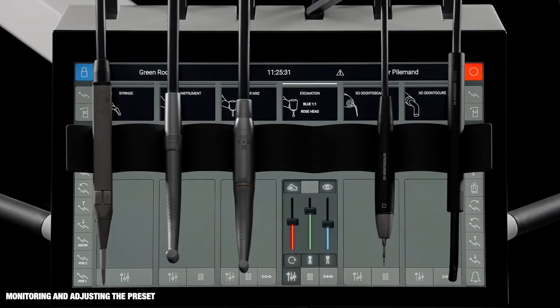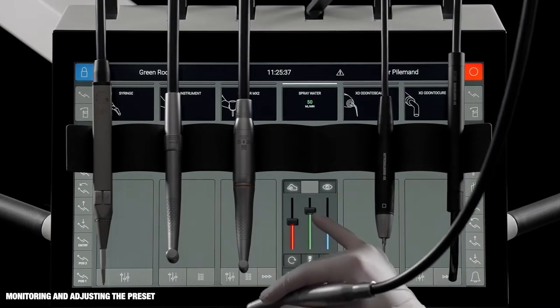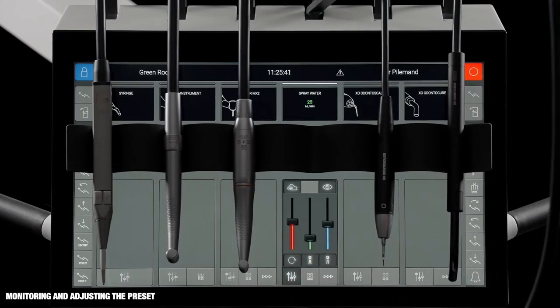It's possible to monitor and adjust a preset. Tap the green slider to see the amount of spray water. Adjust the spray water if necessary or switch spray water off.